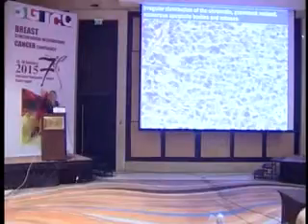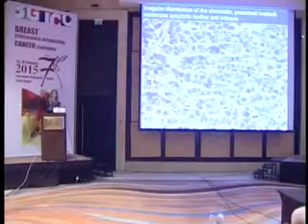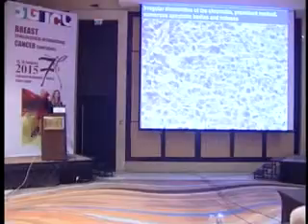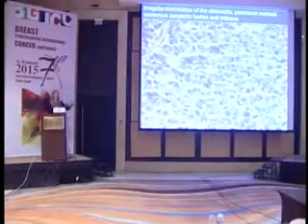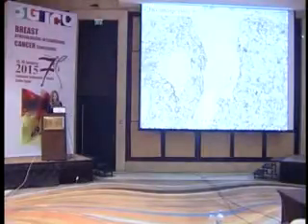So look more here. This is high power. But look from low power. If you practice your eyes, go low power, high power, for the junior and for the trainee in the room. Low power, high power, and you pick up an image in your head about neuroendocrine. And it's the same in the lung, in the cervix, anywhere. They look the same.